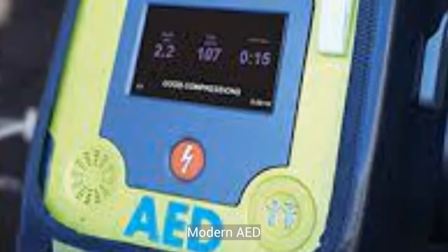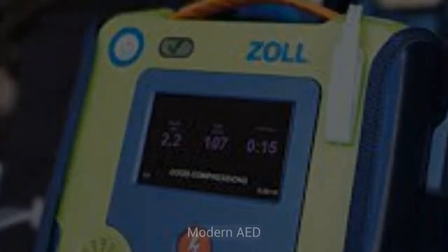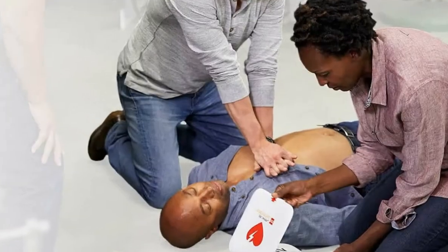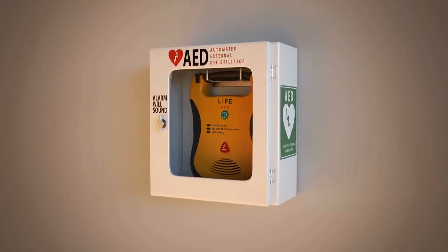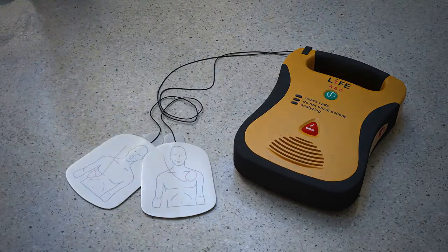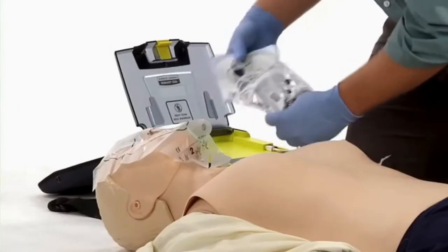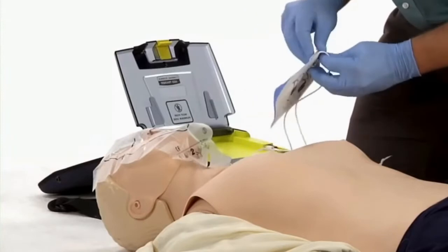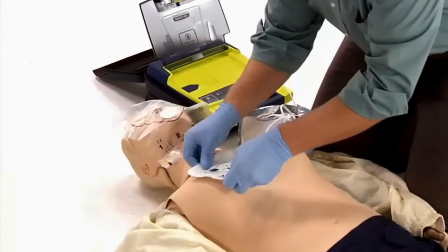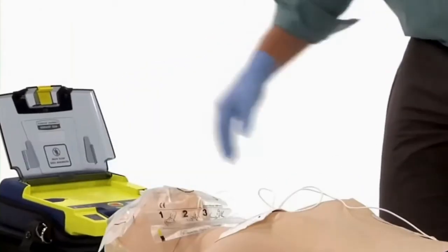To understand the history of AEDs, you must first know how they work. AEDs are used in emergency situations involving cardiac arrest. Unlike normal external defibrillators, they are portable and are usually found in places with a large number of people, such as airports and schools. During normal use, two thin pads containing electrodes are stuck to the patient's chest, and the patient is then shocked, which is supposed to restart or return the heart's rhythm.